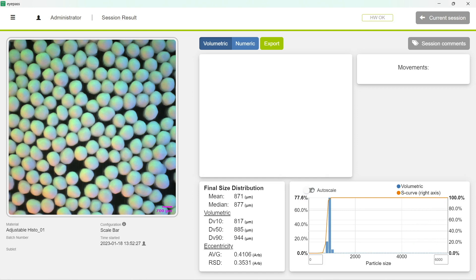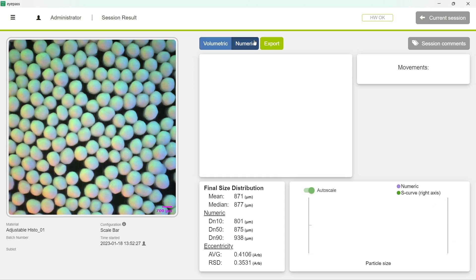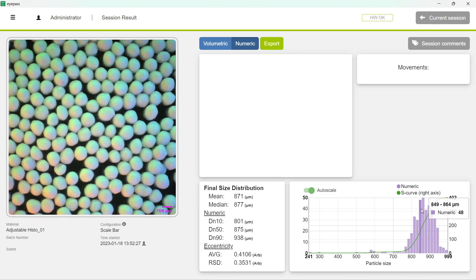And have it displayed both in volumetric, that has this deeper shade of blue, or numeric, which is the soft lavender. And we have decided to use different colors so you could easily identify what mode you're measuring your session in.